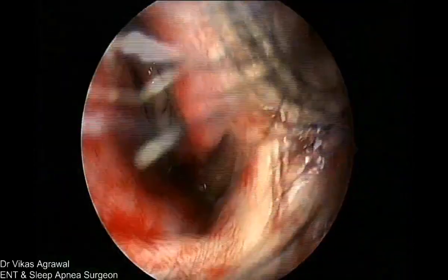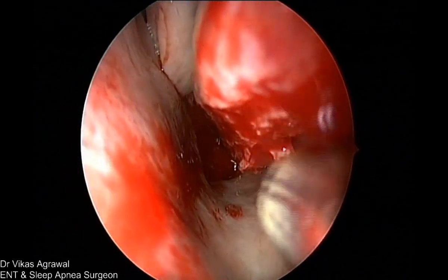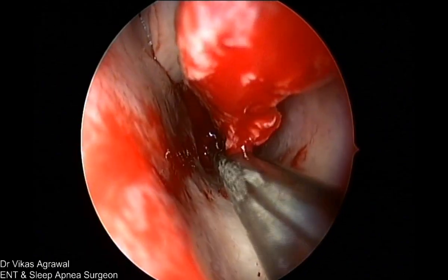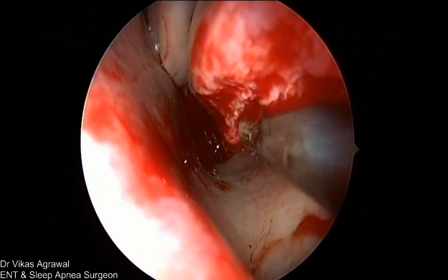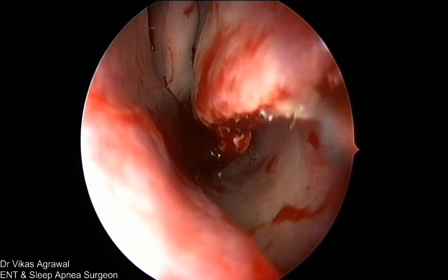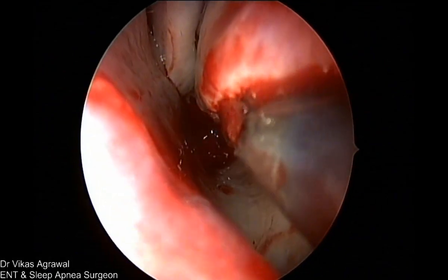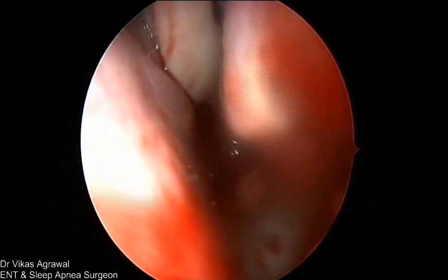Suction cautery. What happens is, when you cut the bone, I'll just show you where. See, here it's not bleeding heavily, there's no heavy bleeding here. But if you go into this part of the bone, the inferior turbinate blood supply comes from there, and then you can have heavy bleeding. You can do coblation, you can do cautery. Cautery is much faster and easier, and on the bone, cautery works better than coblation. Suction.